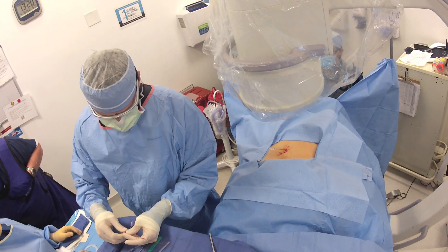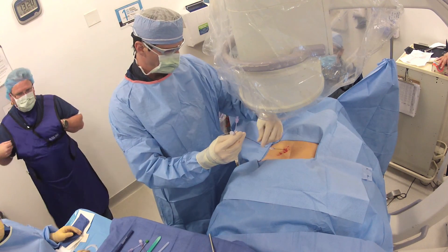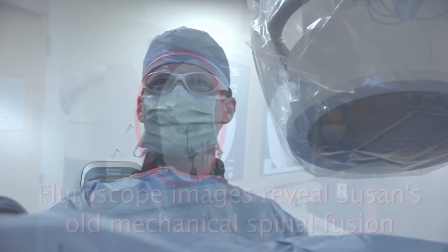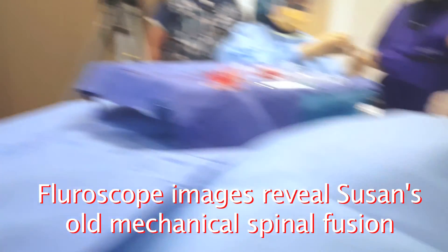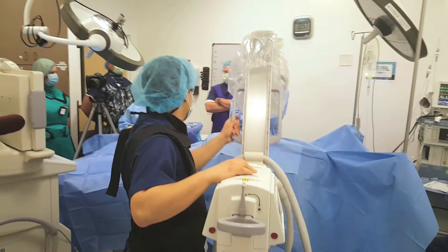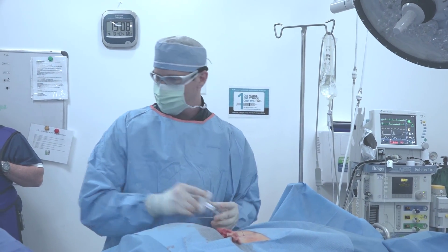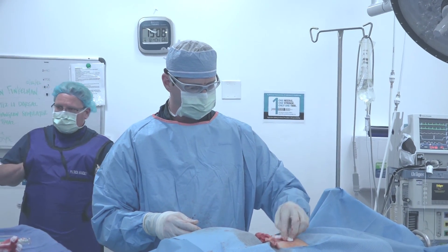We're doing a dorsal root ganglion stimulator insertion. That is supposed to take care of nerve root pain. Good news is we got the L1 nerve root covered, and we're hoping that a lot of her pain is going to be coming from that L1 source.